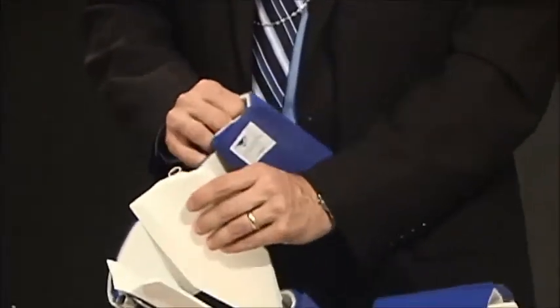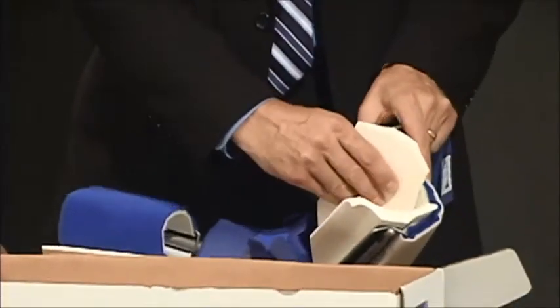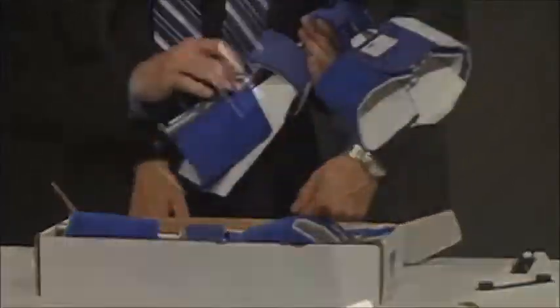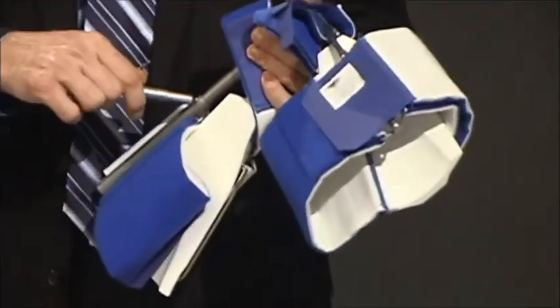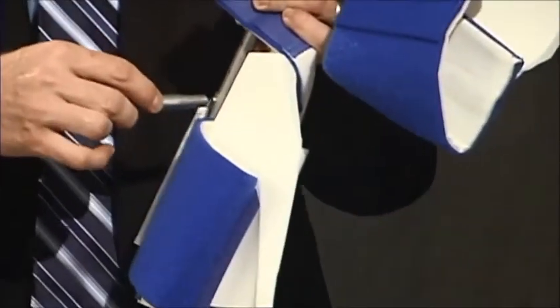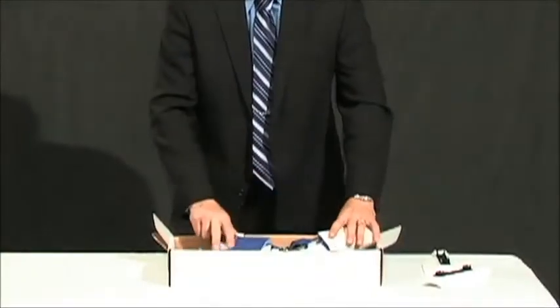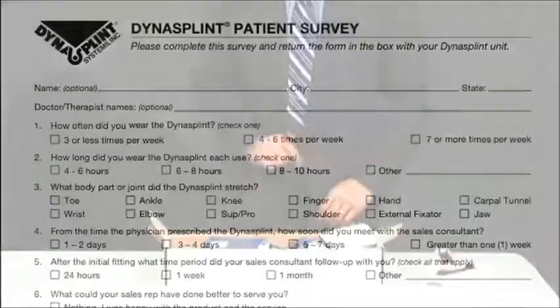If the splint will not fit in the box due to bulk, snap out the knee and calf pads on one side of the splint. If the splint is too long to fit in the box, shorten both sides of the struts by either pulling the pin or removing the screw to collapse the splint.